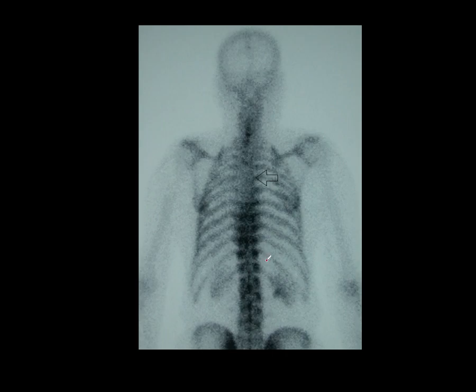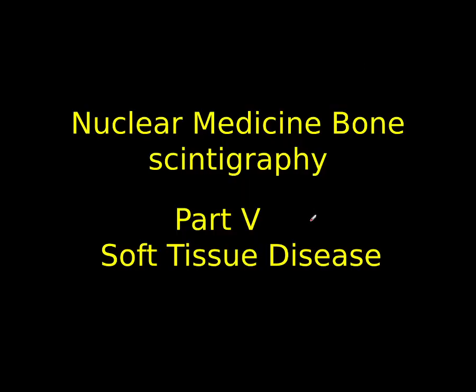One more thing to mention: this is a patient who had hyperfractionated radiotherapy for carcinoma of the lung. Radiotherapy causes devitalisation of bone, so there won't be any tracer uptake afterwards. This photopenic defect in bone is caused by a radiotherapy portal — devitalised bone — not a lytic metastasis. Like radiotherapy portals elsewhere in the body, it has a sharp outline. Don't get confused by it. We'll call it a day there, and in the next talk we'll speak about soft tissue disease. Thank you.